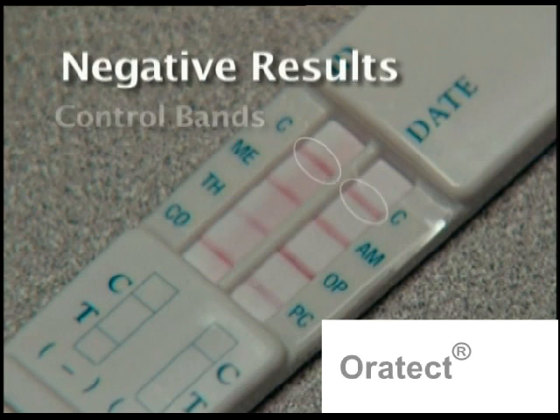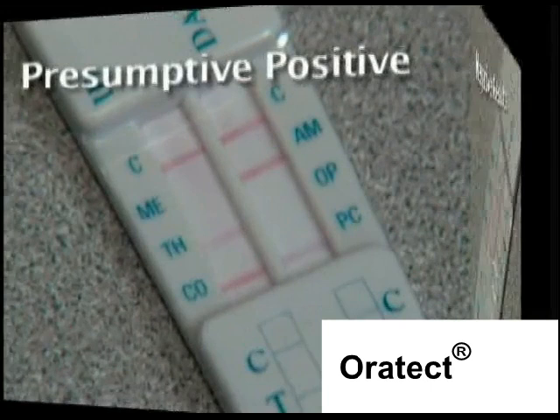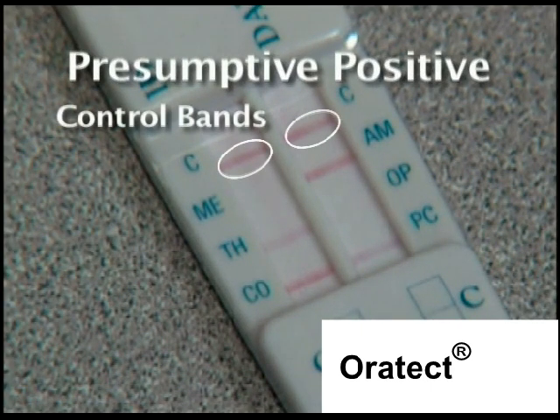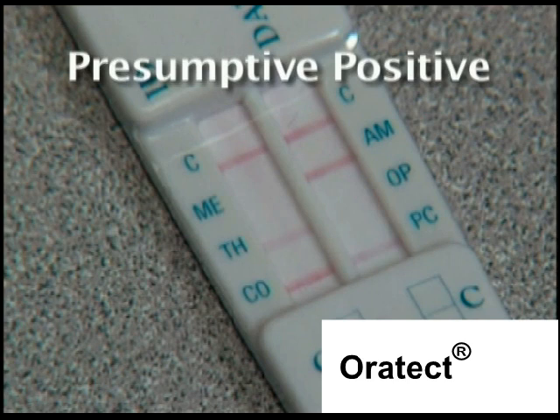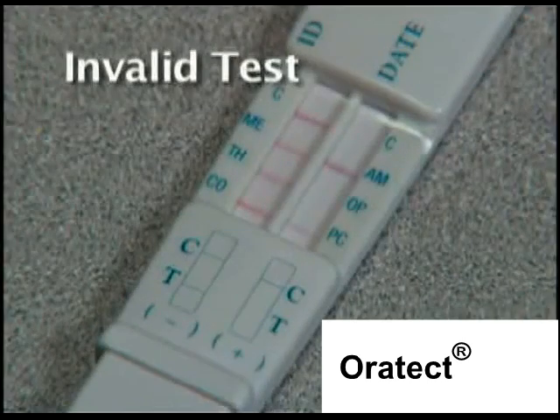Negative results are ready to interpret once the control bands C form. Any band in the test region that can be seen visually, no matter how faint, is a negative result. Presumptive positive results can be interpreted once the control bands C form and the membrane background clears in 5 minutes or less. A presumptive positive result will show no band in the specific test area. Results are stable and may be interpreted for up to 30 minutes after the control bands C form.